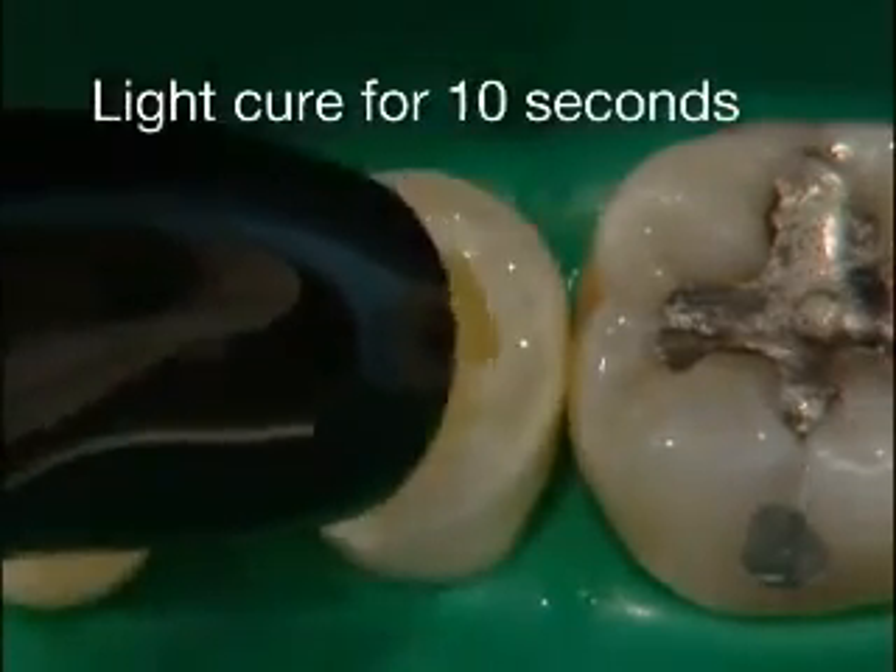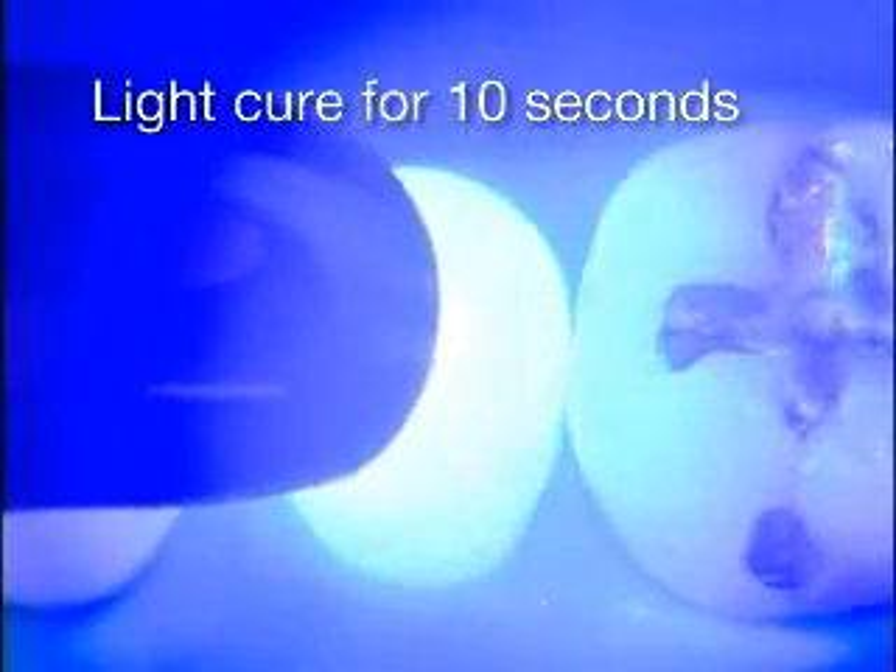Light cure for 10 seconds. The surface is now ready for composite placement.